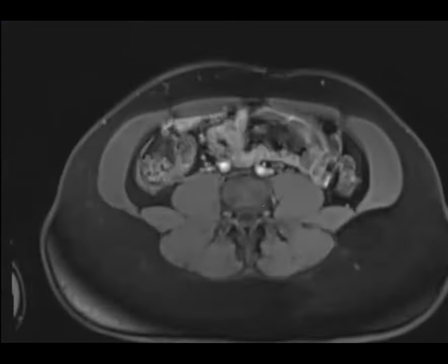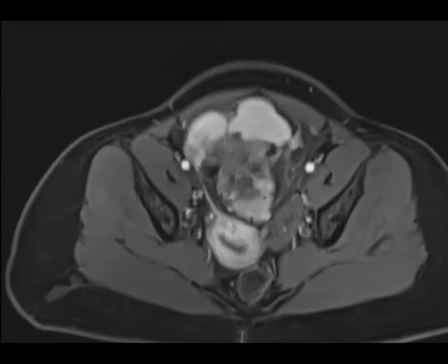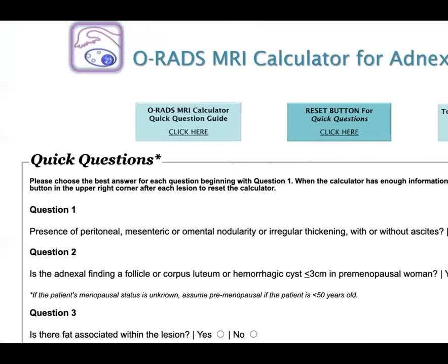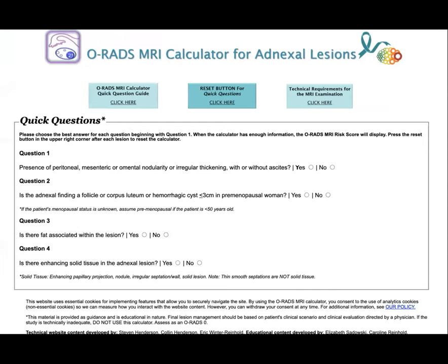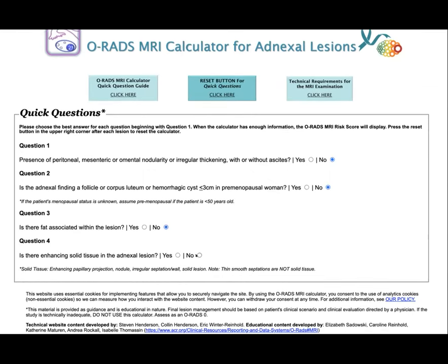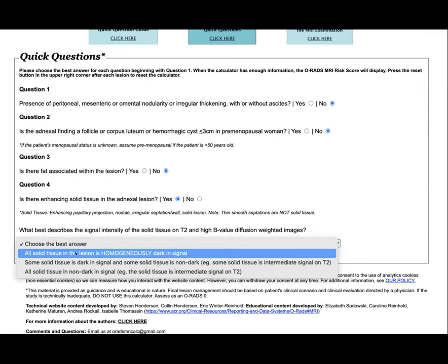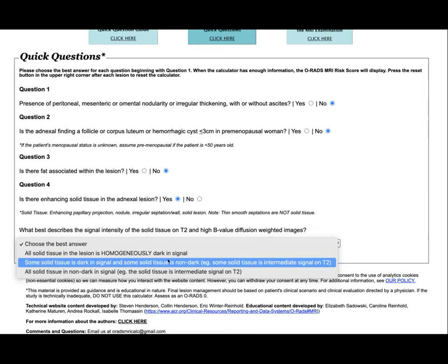On the T1 pre-contrast, there are all these bright areas, and on post-contrast the non-bright areas were enhancing — definitely a solid mass with either hemorrhagic or mucinous components. I wanted to show you the ORADS calculator. First you ask: is there peritoneal disease? No. Is it a hemorrhagic cyst? No. Is there fat? No. Is there a solid enhancing part? Yes. Then: is it homogeneously dark — if so, you'd think fibro-thecoma, ORADS 2, low risk. If some is dark and some non-dark, it's intermediate. My lesion was all non-dark since none of it was as dark as muscle.